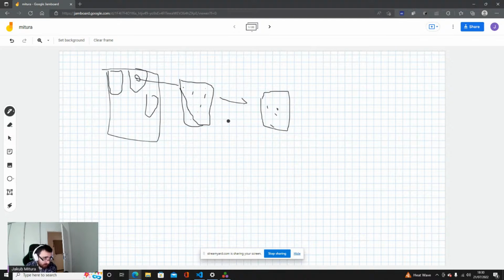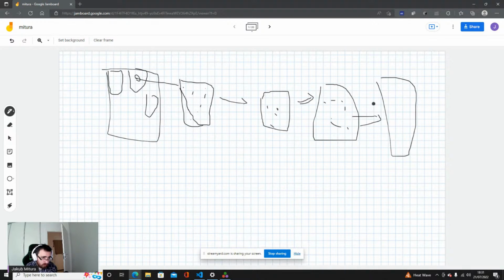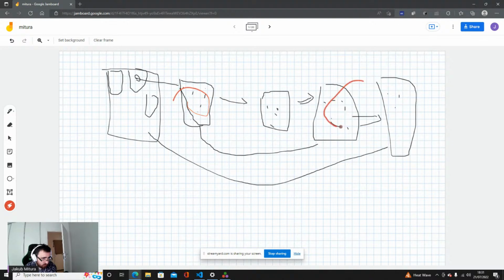However, in the case of the U-Net, we then have the deconvolutions. So we get bigger and bigger again, as you have seen in the code, and we'll get back to it in a moment. Why is this done? This is done in order to be able to get some skip connections between the layers. The skip connections will work only if the layers have the same dimensions. So when we have done some pooling, we need to do some deconvolutions, basically.